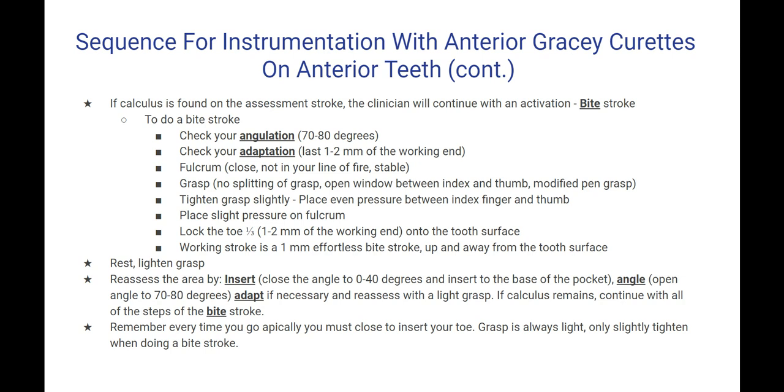If calculus remains, continue with all of the steps of the bite stroke. Remember, every time you go apical, you must close to insert your toe. Grasp is always light, only slight tightening when doing a bite stroke.